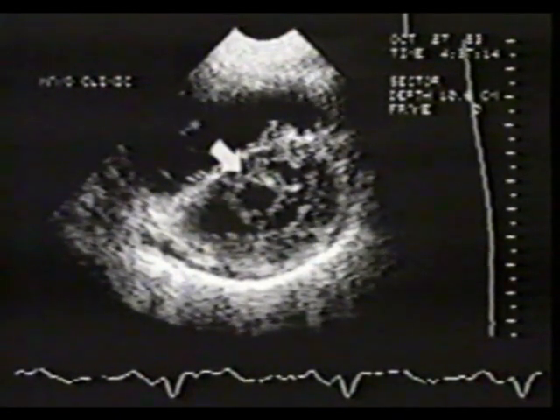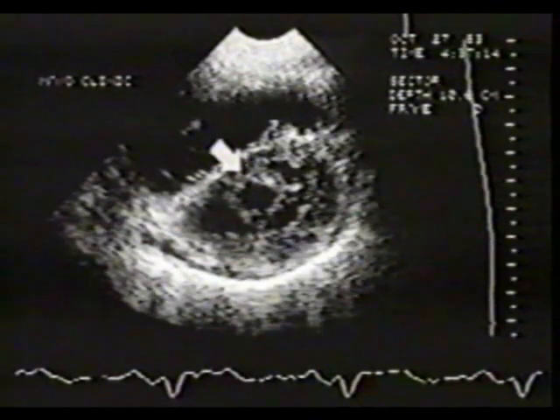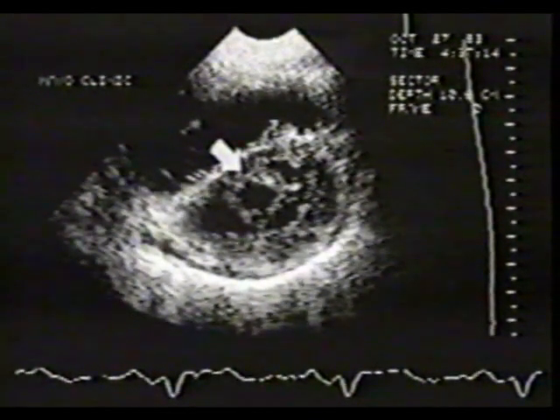In real time, the image will move slightly back and forth with respiration. Focus on the characteristic fish mouth appearance of the stenotic mitral valve.